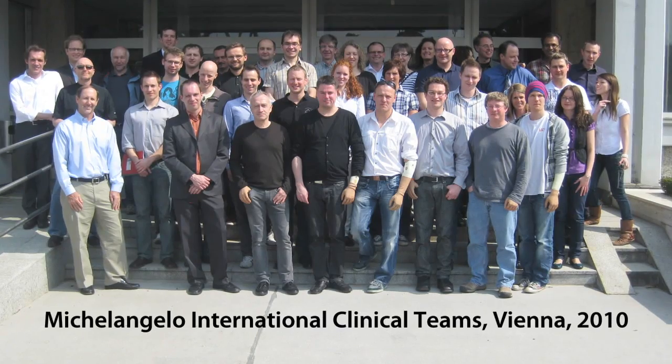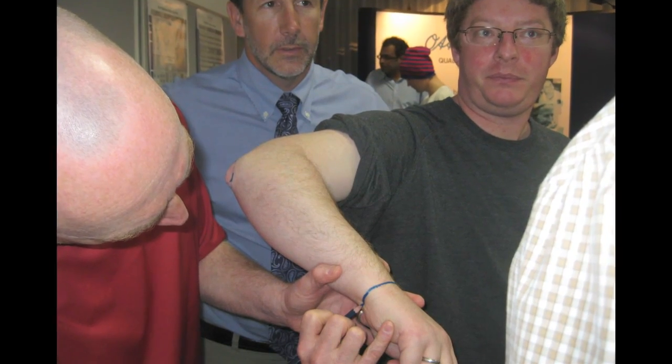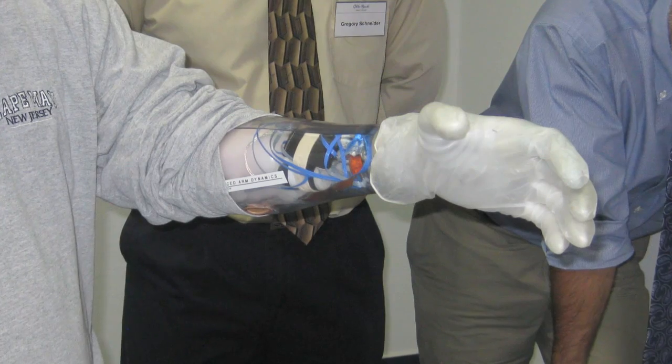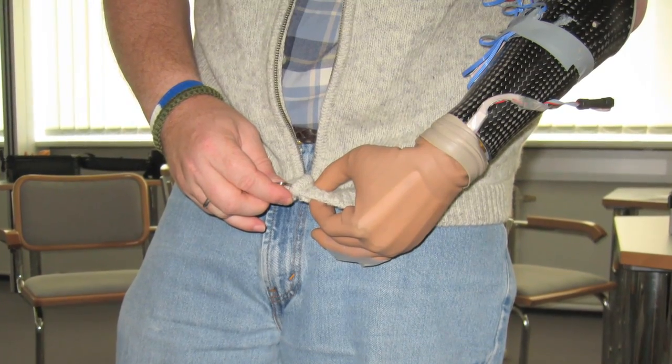As one of the first people in the world to try this hand, you had the unique opportunity to go over to Vienna and be involved in the testing of it. Can you tell me a little about that experience? I really enjoyed the opportunity to go to Vienna, particularly because we got to work with everyone involved with the production of the Michelangelo hand — from the engineers who designed the original product, to the programmers, to occupational therapists, to the prosthetists. It was a very dynamic, multidisciplinary process where we got to investigate many of the different functions of the hand, from daily functionality as well as materials, strengths, and the capabilities of the hand itself.